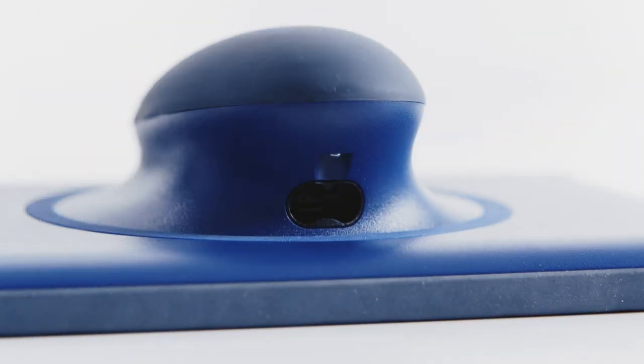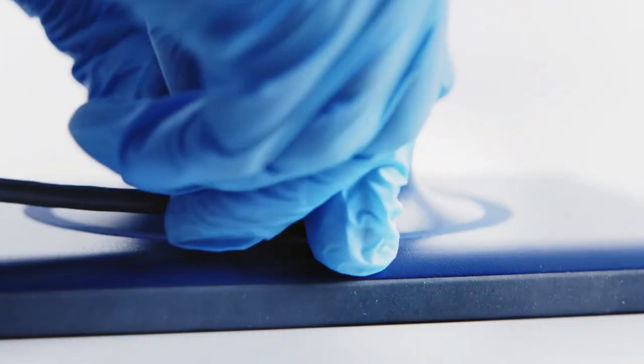To get started, attach the torso probe to the bridge in the port beneath the bridge's handle. Follow the grooves which guide the cable into place.